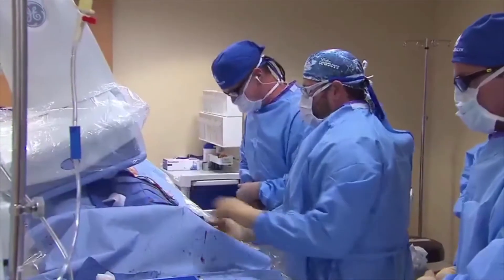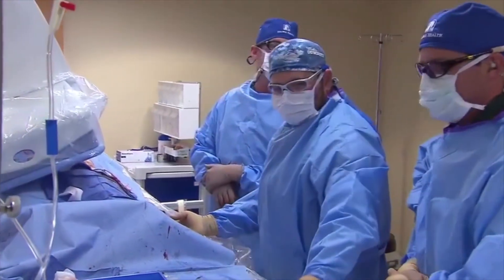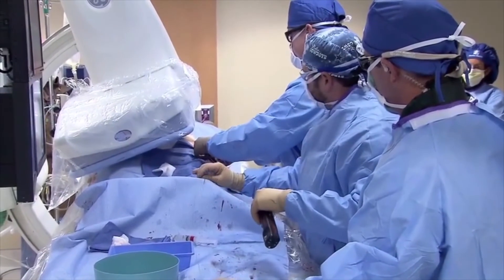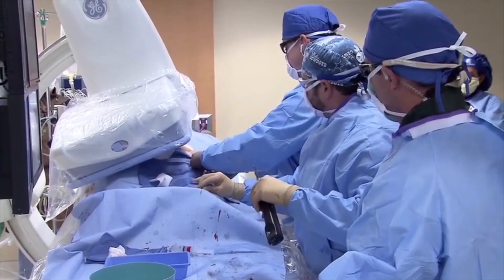We've got our atherectomy device in position. On the live fluoro screen you can see the atherectomy catheter — it has a little notch right at the very top of the screen, and that's where the cutting blade is. We're going to bow against the wall of the vessel, turn the blades on, and sort of shave the plaque off the inside of the vessel. We've made a few passes with the atherectomy catheter.